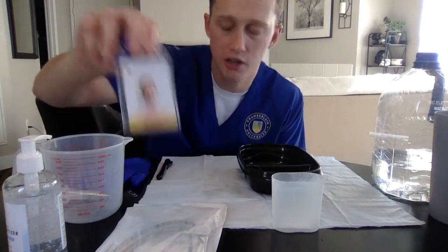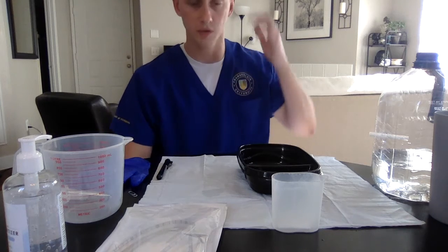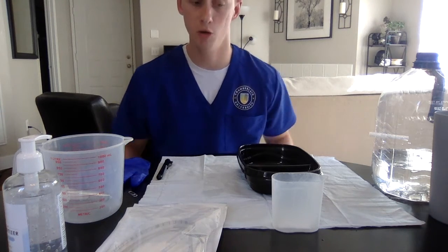This is Ryan Wojciechowski. This is my week 6 clinical learning activity for NG insertion and removal. So I have all my supplies in front of me here.